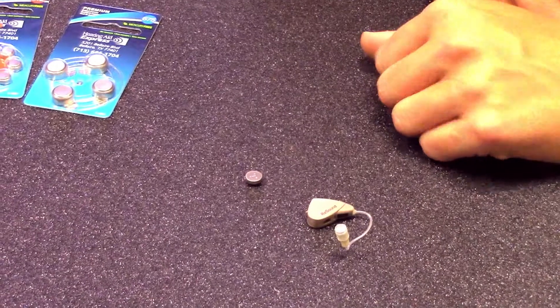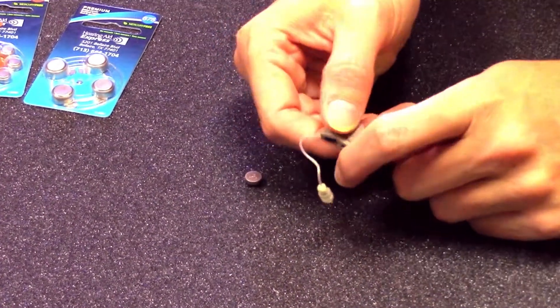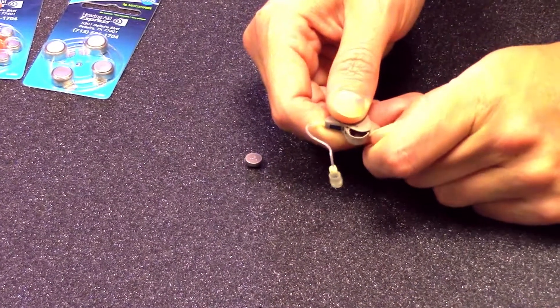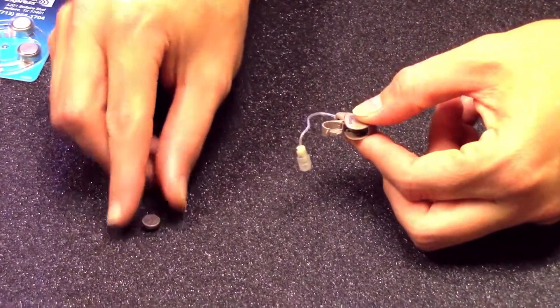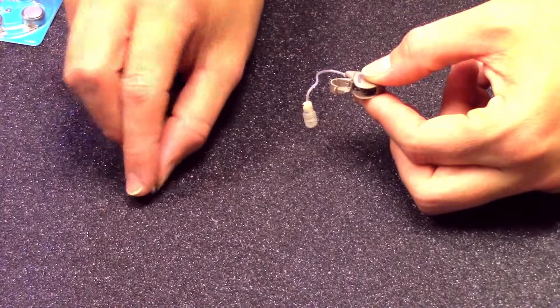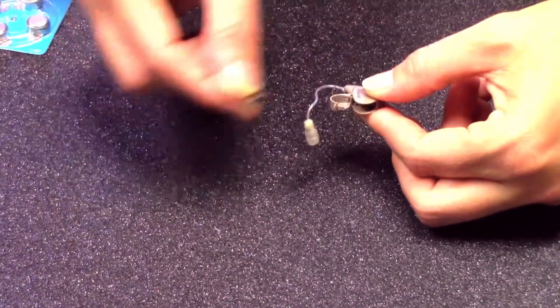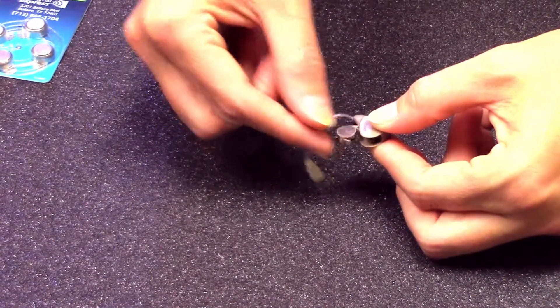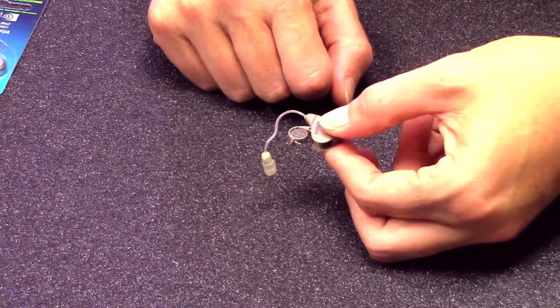Once you've let it sit for about a minute and a half, you're going to open up the battery door. Typically these hearing aids have a battery door that swings towards the interior portion of the hearing aid. There is a positive side, which is the flat side on the battery, and there is a negative side, which is the beveled side. The beveled side, or negative side, goes down and the positive side, or flat side, goes up. Once it's placed completely flush within the battery door, you close your hearing aid and you're ready to go.